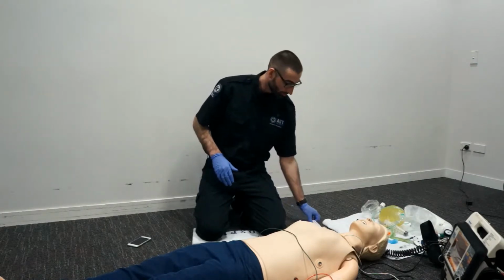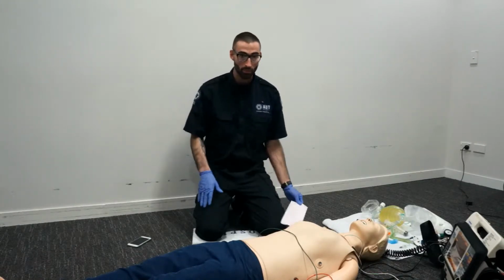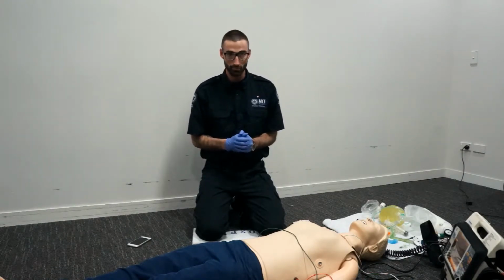On the 12 lead, we note that we have precordial concordance and that we have extreme axis deviation. Steve is old and has extensive cardiac history, so these signs are all indicative of VT. So with this information, we're going to go ahead and call for backup and prepare for a cardioversion.